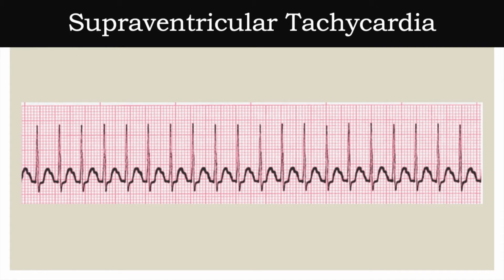And then you're going to have the ECG, and then you're also going to have the pads placed just in case you need to give the patient CPR and shock them. Okay, you have to have all of that, and you cannot be by yourself. Obviously, you have to have a team. Okay. There has to be multiple nurses or whatever people in the room. You're never going to be alone.